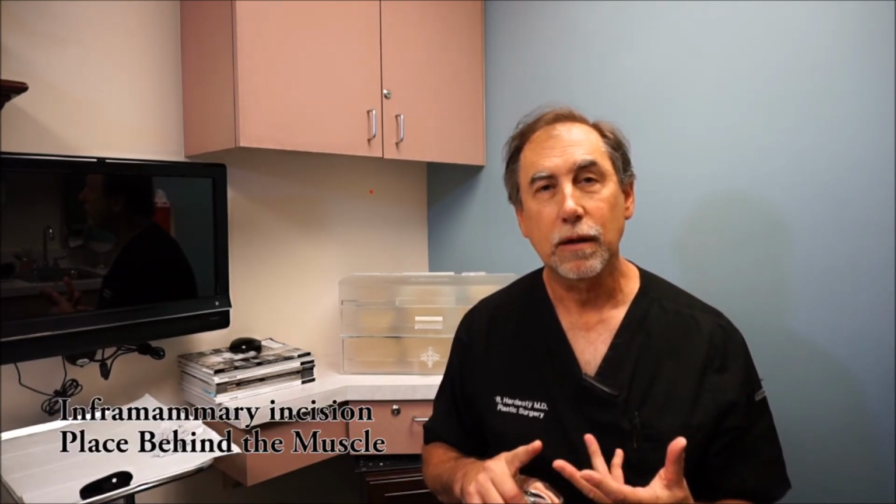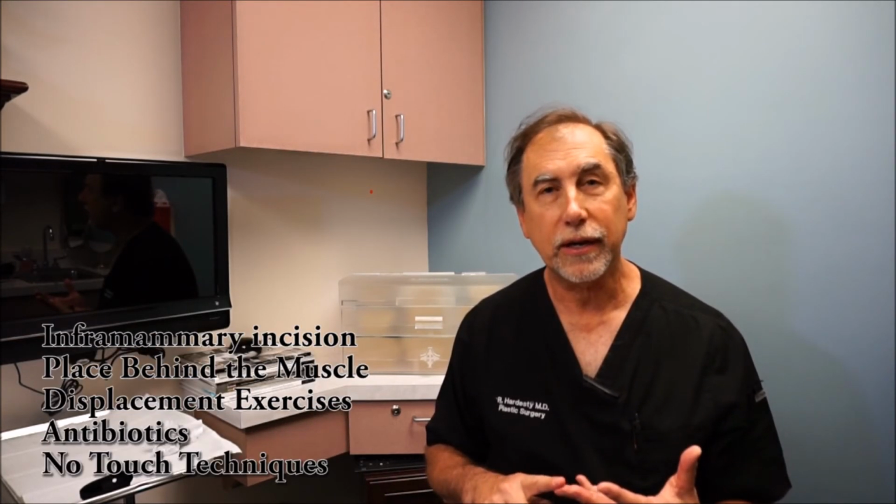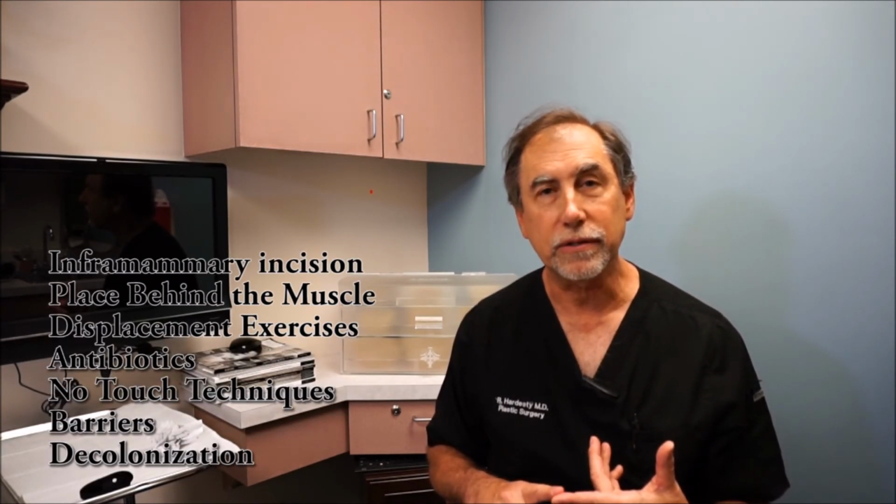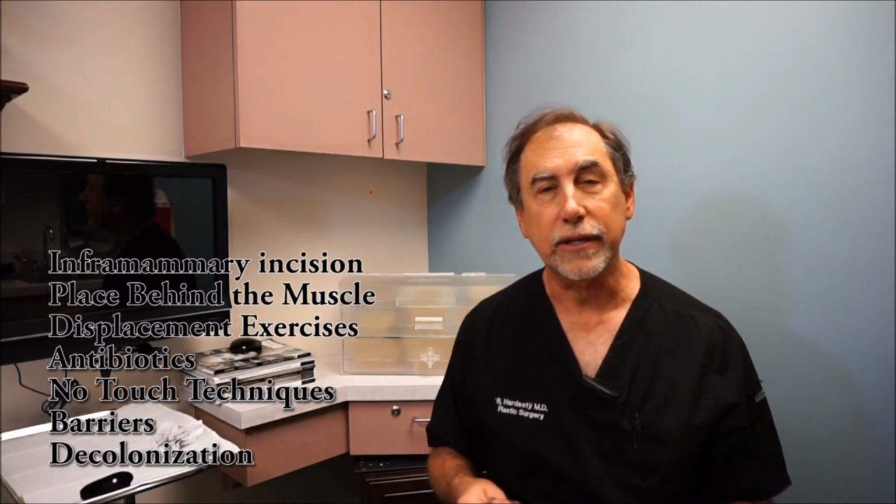So, in summary, capsular contracture is a known phenomenon. It has an incidence of 1 to 20%. There are things that we can do to prevent it. Inframammary incision, we place the implant behind the muscle, displacement exercises, the use of antibiotics, no-touch technique, barriers, decolonization. This really lowers the incidence. And then lastly, it takes follow-up and the patient getting an understanding of what the breasts feel like.